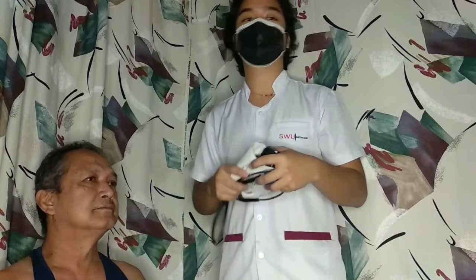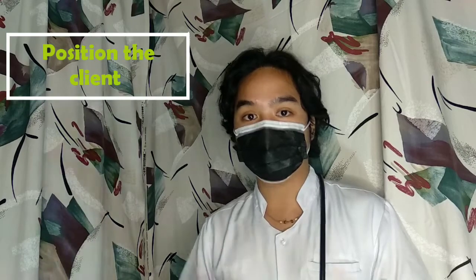After asking those questions, you need to position now your patient. If the patient is sitting, you need to position the feet of the patient flat on the floor, not crossed legs. Because if the patient crosses his legs, there will be a false increase in the blood pressure.